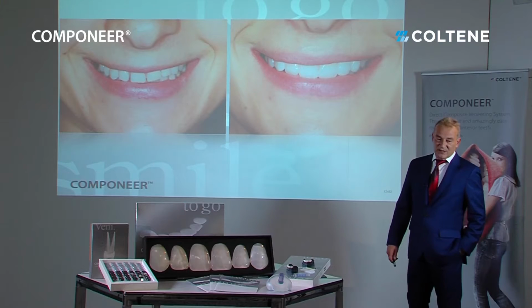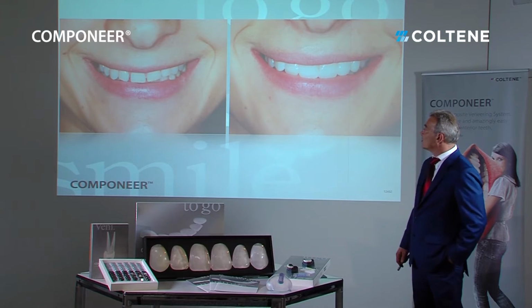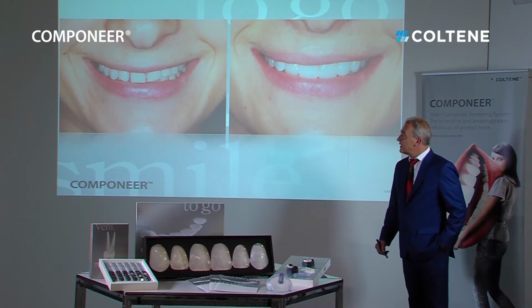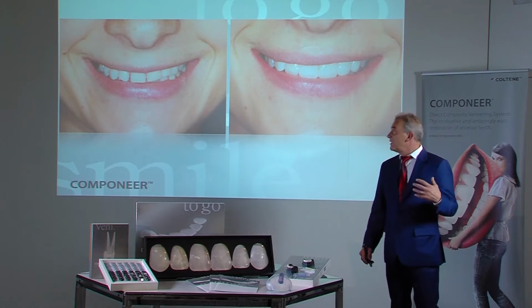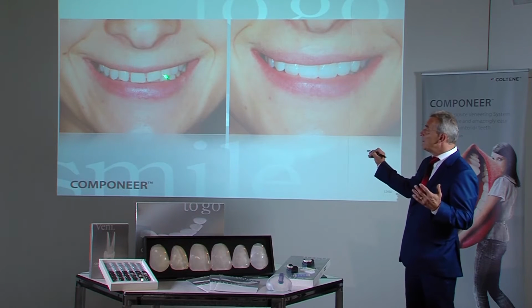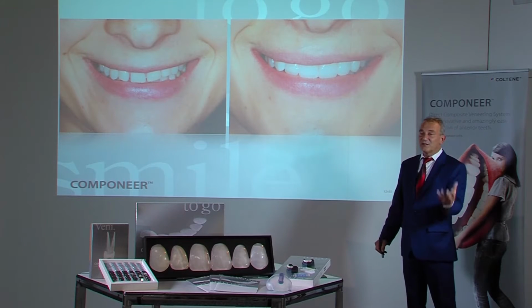In this chapter, we will be dealing with diastemas. This means small and large gap closures. As mentioned in the chapter Diagnosis, contrasts are a major problem. As soon as a contrast meets white tooth material, this is irritating.